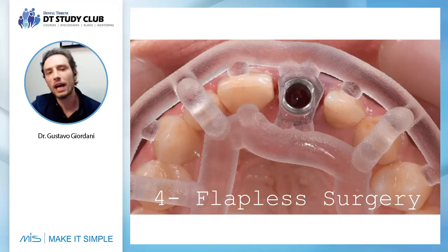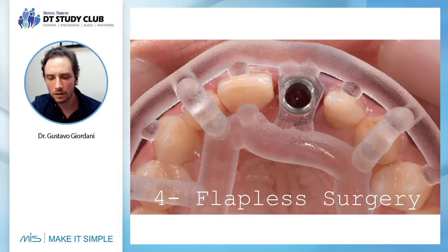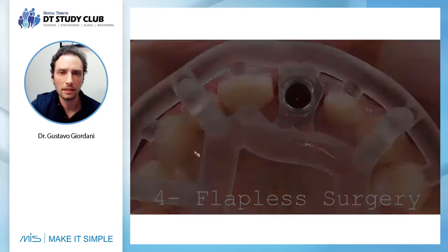I'm not saying that when you do guided surgery, you need to be flapless all the time. It's not the same. Opening the flap is not about being guided or not being guided. Opening the flap is about the soft tissue procedure that you need to do, the graft that you need to perform. So it's about other things, but of course, when you are guided, it's easier not to open the flap because you are guided by a very nice guide, which is this guided surgery from MIS.